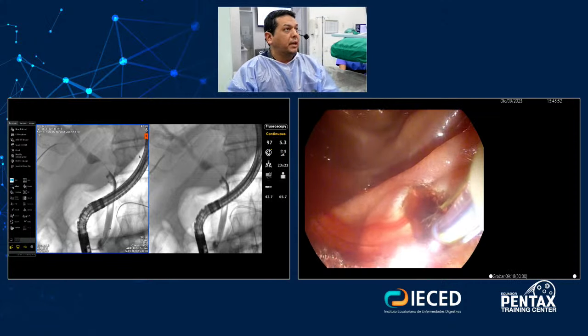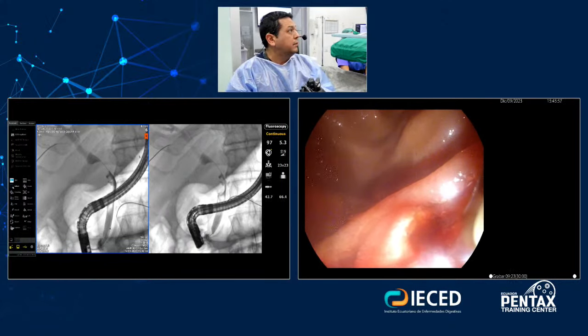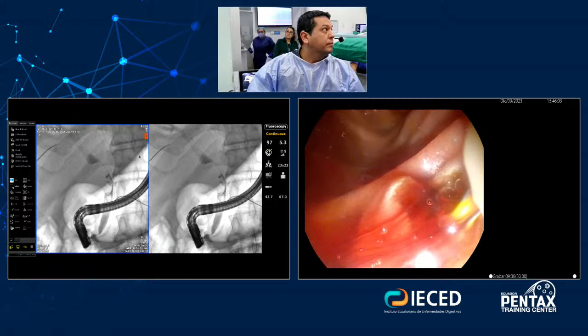So I do the sphincterotomy now, and I will pass my cholangioscope here.